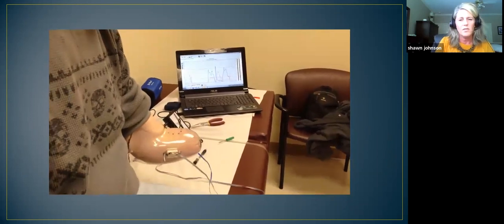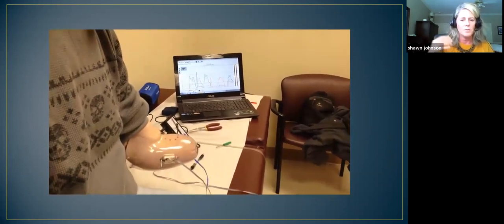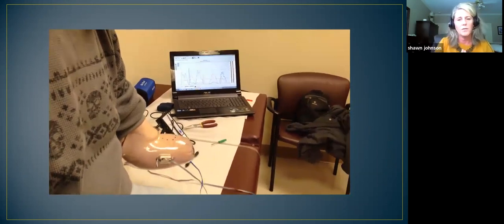And so if they're able to operate this virtual thing within a test socket, great. If there's a lot of effort and struggling and shaking going on, then maybe we need to find some more sites or turn up the intensity, the sensitivity of the electrodes, or within the computer programming.